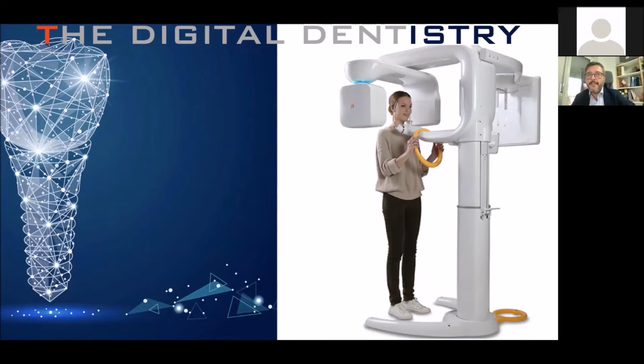Fast and easy image generation may lead to a relatively unnoticed increase of radiographs. The dose reduction of digital systems might be offset by additional radiographs and incorrect exposure parameters. Even within the film-based system, dose reductions of up to 50% are achievable by using high-speed films and radiation protection measures.